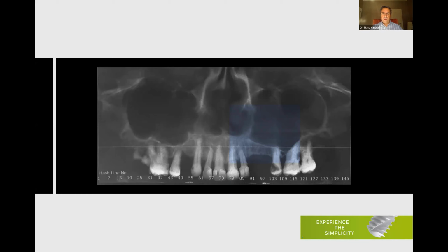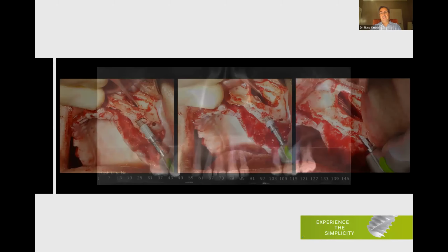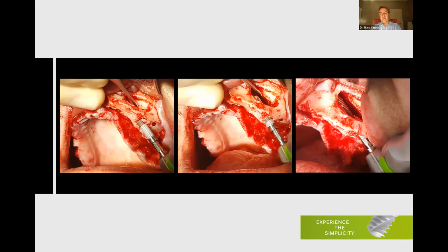You see, on the left side, if we are going for a standard procedure, tilting the implant 45 degrees, the screw or the abutment will come out on the canine, which is not acceptable because we're going to have a big cantilever. So in order to have the implant coming out on the 5 or on the 6, we can go through the sinus in a situation like this because we have a good external nasal wall. So we will point to that wall, and again, we lift the sinus, and with a 20 millimeter implant, we can reach the nasal floor and get anchorage to the nasal floor going through the sinus. Then we graft, and we compensate the tilting of the implant with the 30-degree abutment.